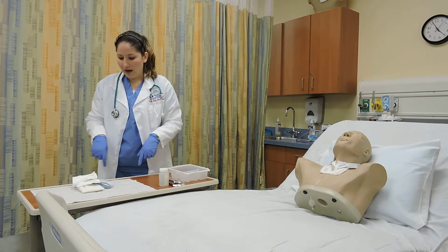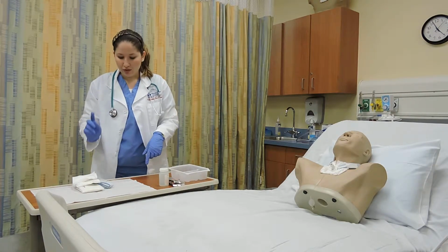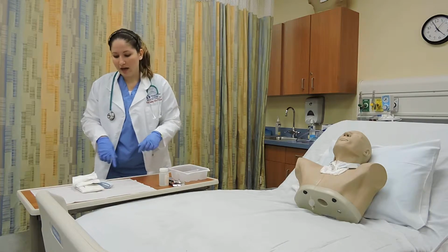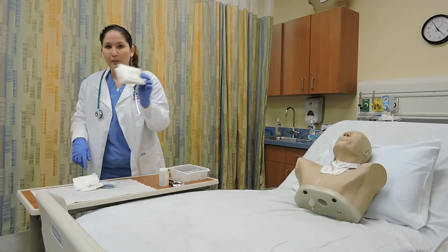Inside the kit we also have 4x4 gauzes, a pre-cut 4x4 gauze, a brush, Q-tips, a tracheostomy tie, and the sterile gloves, which I'm going to put on at this time.